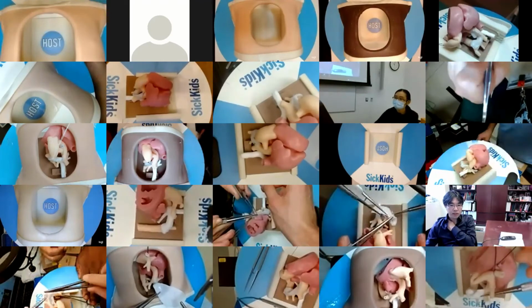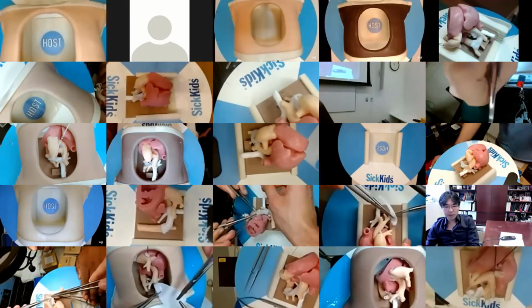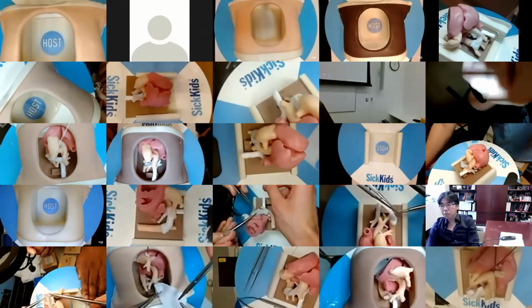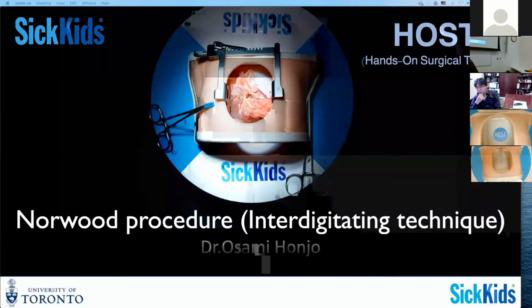So this technique is called the interdigitating technique, and it was pretty much developed by Dr. Van Nastel. Hopefully he's here with us on the call. Essentially I've learned everything from him, so it's not really my technique, but I'm happy to share.